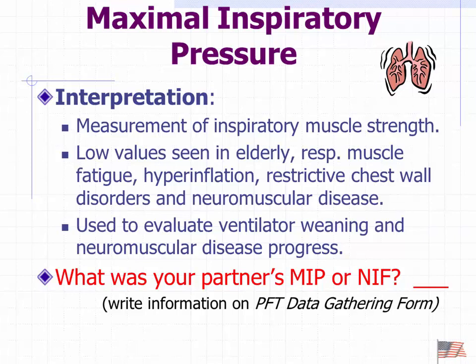What does NIF stand for? Negative inspiratory force. It's what we used to call the maximal inspiratory pressure, and it's actually a bad term, so we're not using it. We use MIP, which is a more appropriate term. But if you go into the ICU and talk to some old therapists, they'll call it a NIF, negative inspiratory force. But it's not a measurement of force, it's a measurement of pressure. That's why MIP is the correct terminology. We're not measuring force. And MIP is maximal inspiratory pressure, so it's the same thing.